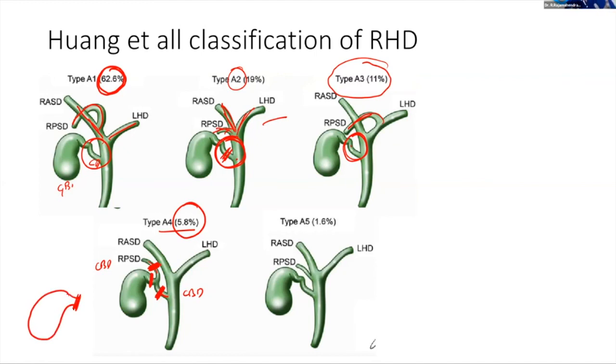You're not doing surgery for a malignancy. Please remember, you're doing surgery only for a benign case. Always put a clip at the cystic duct gallbladder junction. Nowhere will you get a problem. In whatever anomaly, you will never get a problem. If you're putting a clip at the gallbladder cystic duct junction, there is no problem at all. So even for A5, there is nothing to worry. The basic concept is always put a clip at the gallbladder cystic duct junction.